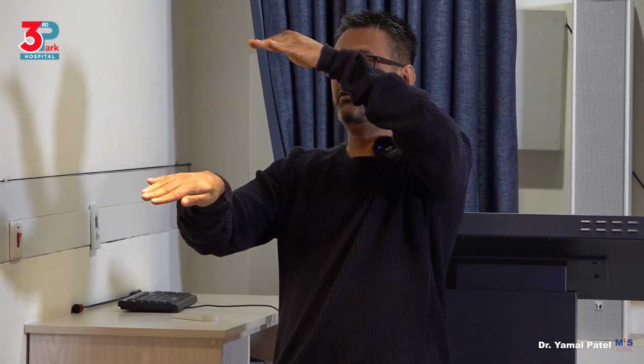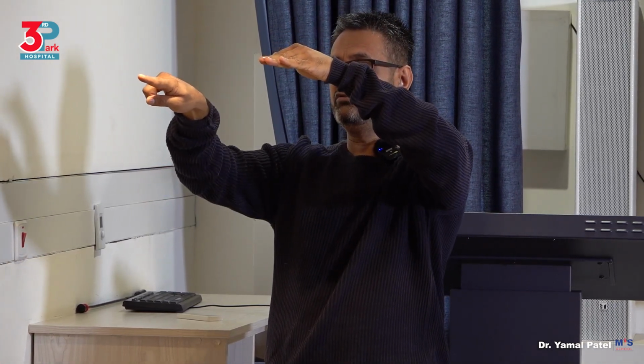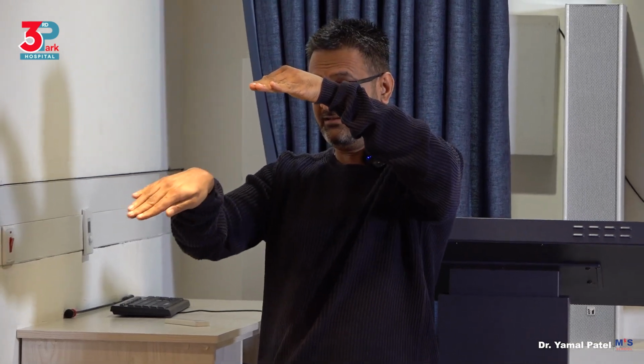Now, if I go too far off, 30 degrees, I'll be able to cut here, but here it's going to be very far from me because my instrument is here. It's straight. It's never going to be going 30 degrees down. So if I'm seeing the pathology at 30 degrees, but my electrode cannot go to 30 degrees to cut it, I will struggle.